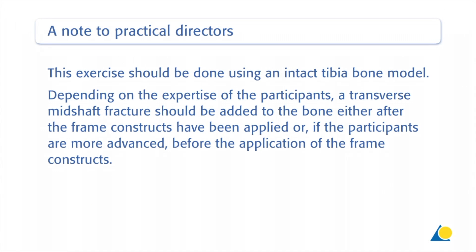A note to practical directors: this exercise should be done using an intact tibia bone model. Depending on the expertise of the participants, a transverse mid-shaft fracture should be added to the bone either after the frame constructs have been applied, or, if the participants are more advanced, before the application of the frame constructs.